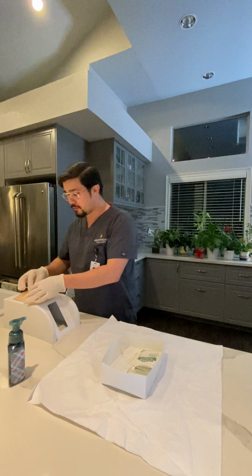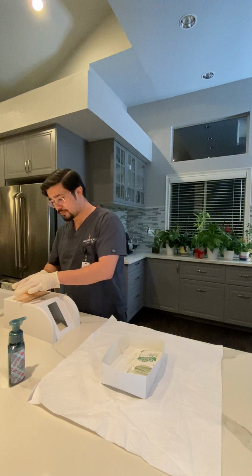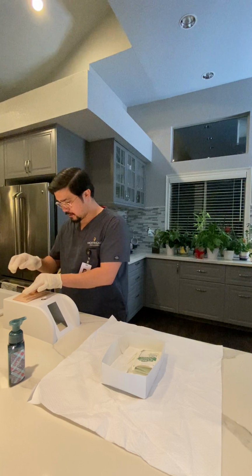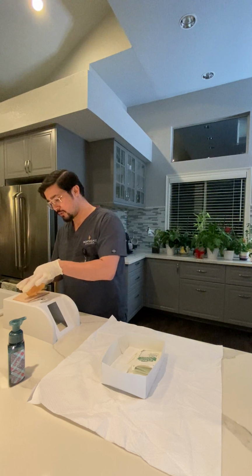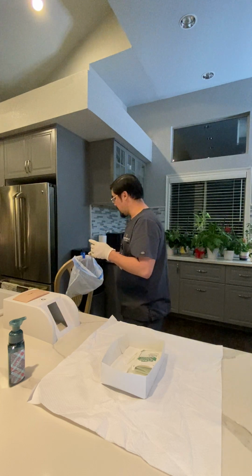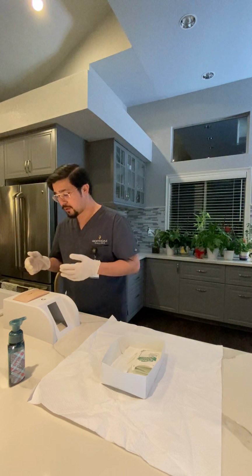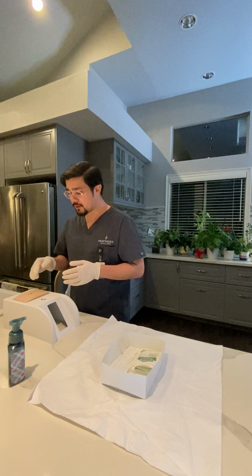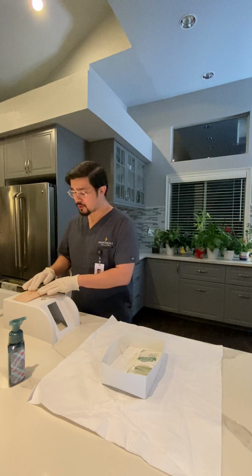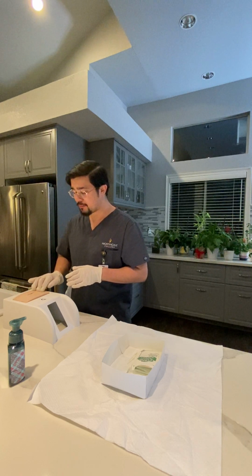So I'm going to begin removing it, pulling towards the center of the wound and lifting it up parallel to the wound there. And I'm going to fold it over and put it into the biohazard bag that I have here. And as I said, I'm assessing the wound. I'm looking for any discoloration, looking at the tissue for any granulation, any changes in color. And I'm also going to palpate the wound for any edema, and that would be evident of any pitting that is going on there.